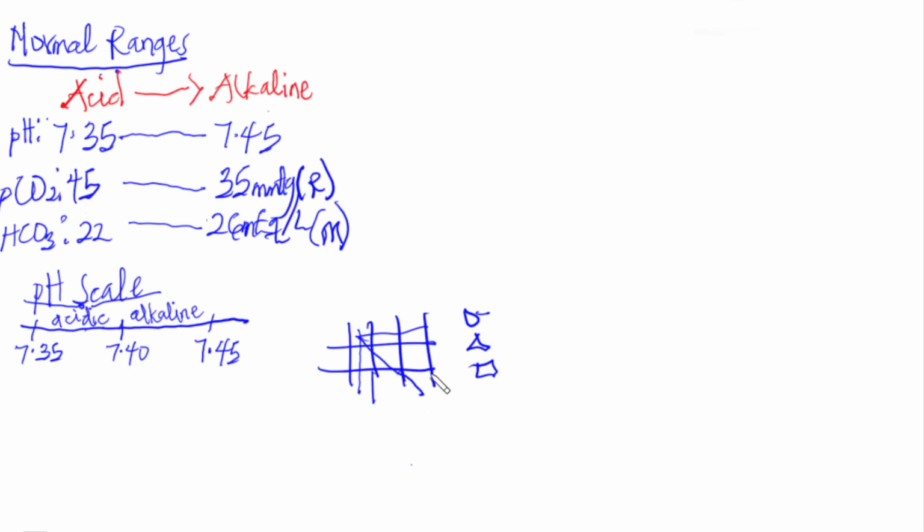You get that? This is the same knowledge we are going to apply with respect to the tic-tac-toe method for interpreting the ABG test. So the column which gets fully filled first becomes your primary condition, or is what wins. Something like that. You solve examples so that you get to understand what I mean by that.